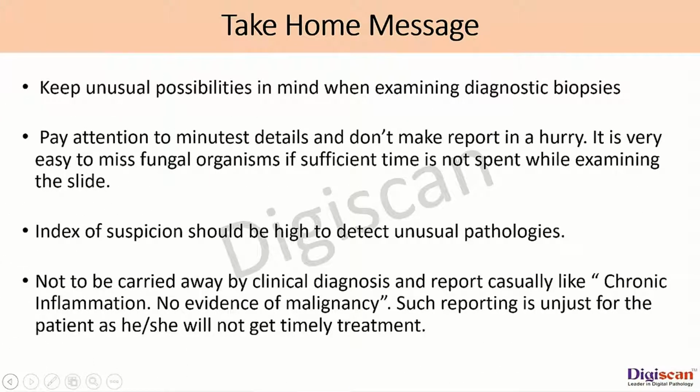So, the take home messages from this case would be that we need to keep unusual possibilities in mind when we are examining diagnostic biopsies and pay attention to minutest details. And it is very easy to miss, for instance, fungal organisms if sufficient time is not spent while examining the slide. And our index of suspicion should be high to detect unusual pathologies.